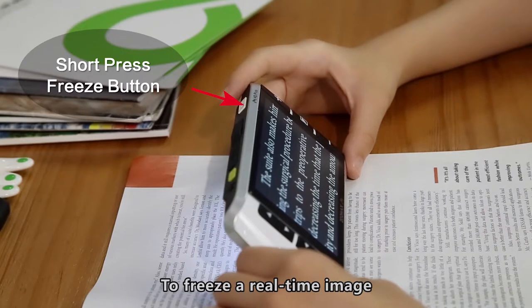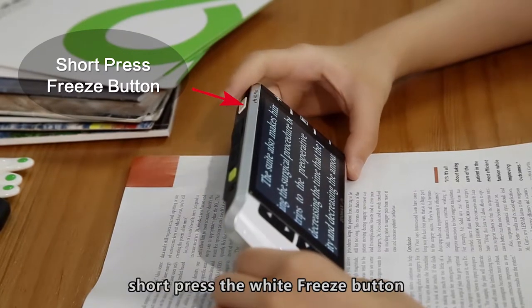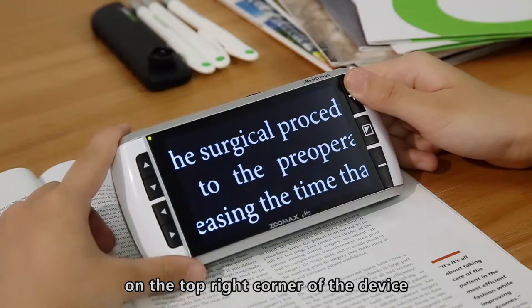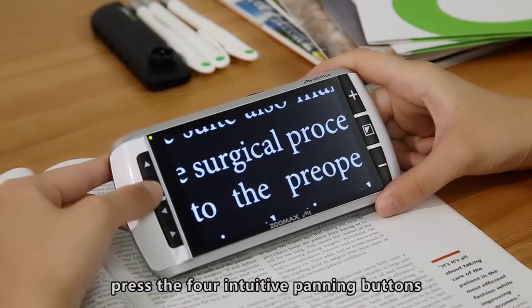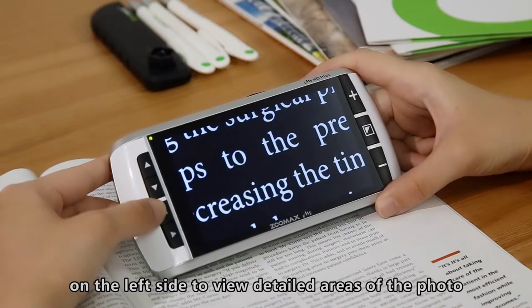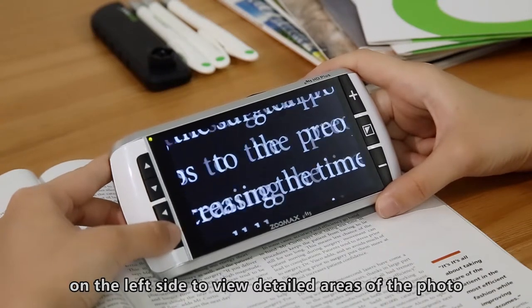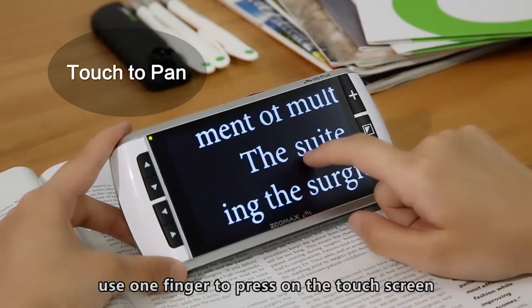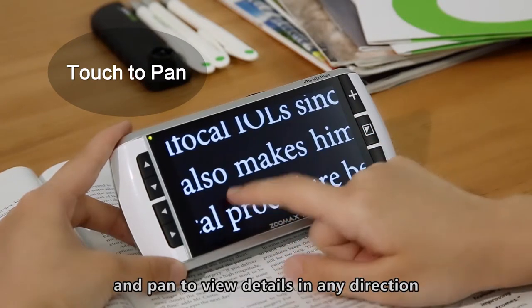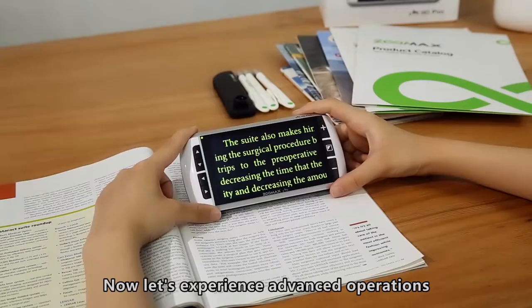To freeze a real-time image, short-press the white freeze button on the top right corner of the device. When the image has been zoomed in, press the 4 intuitive panning buttons on the left side to view detailed areas of the photo. You can also use one finger to press on the touch screen and pan to view details in any direction. Now let's experience the advanced operations.